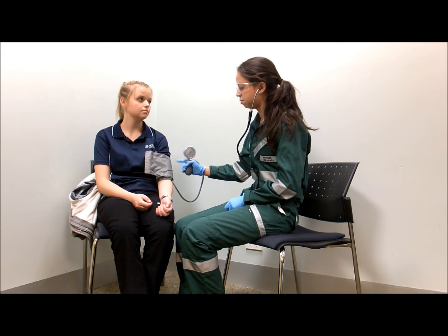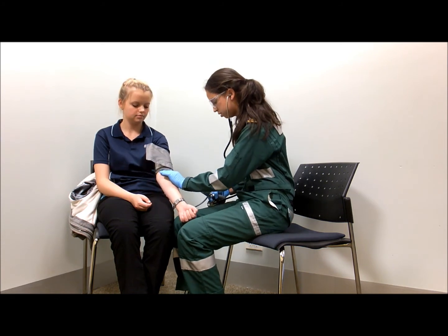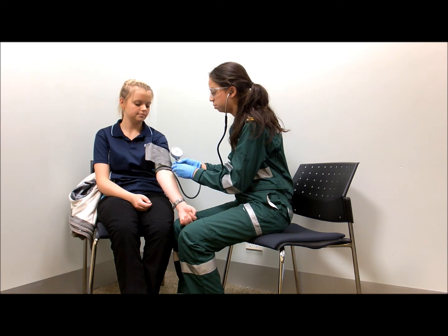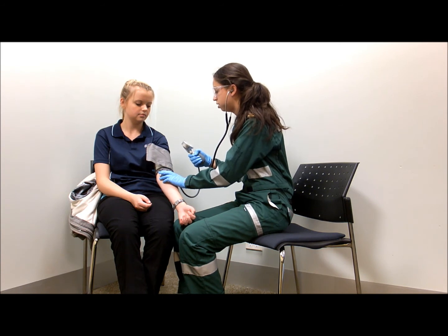Okay, I'm still going to keep the blood pressure cuff 1 inch above the crease of Mrs. Jones's elbow, and I'm going to feel for a brachial pulse. And once I've found this pulse, I'm going to place the diaphragm of the stethoscope directly above it. And I'm going to pump up the blood pressure cuff until I've reached just above her systolic blood pressure.